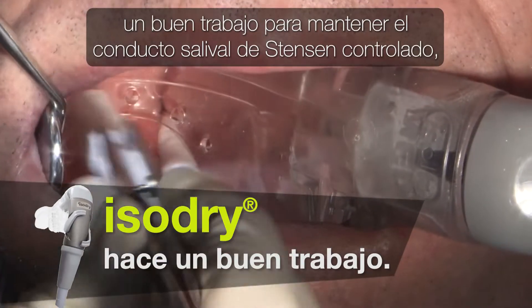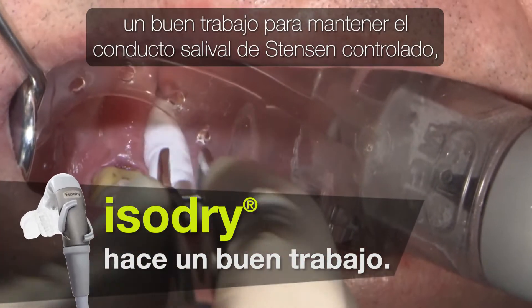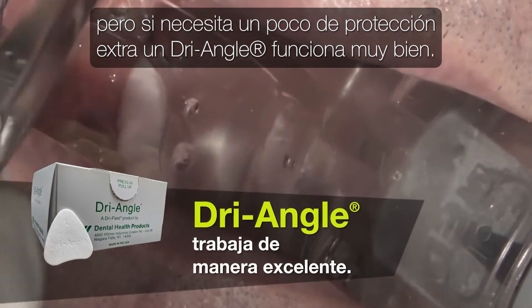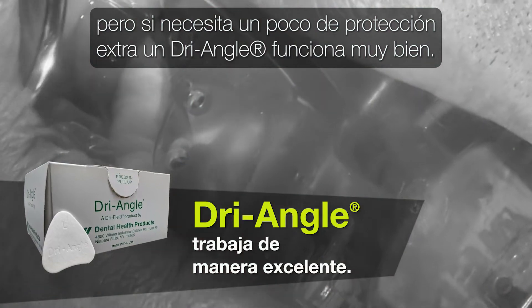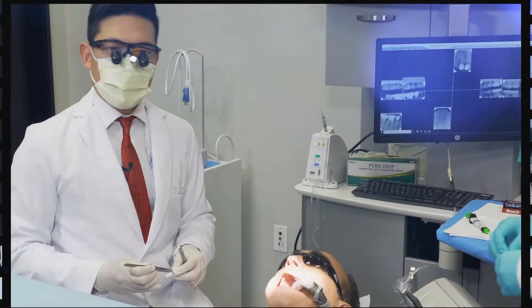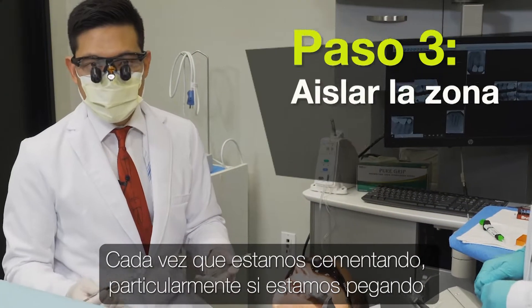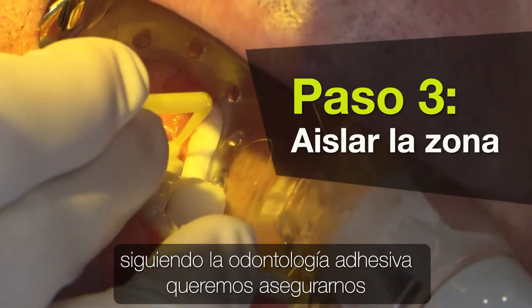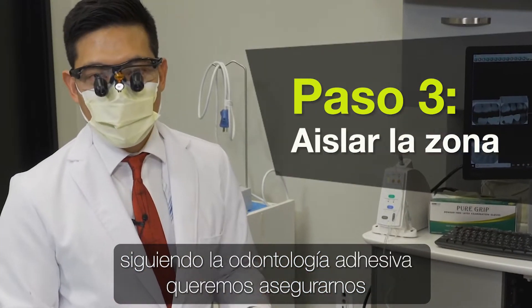The IsoDry does a pretty nice job to keep that Stinson's salivary duct in check, but if you need some extra protection there, a dry angle works really well. Anytime we're cementing, particularly if we're bonding, following adhesive dentistry, we really want to make sure we isolate the area really well.